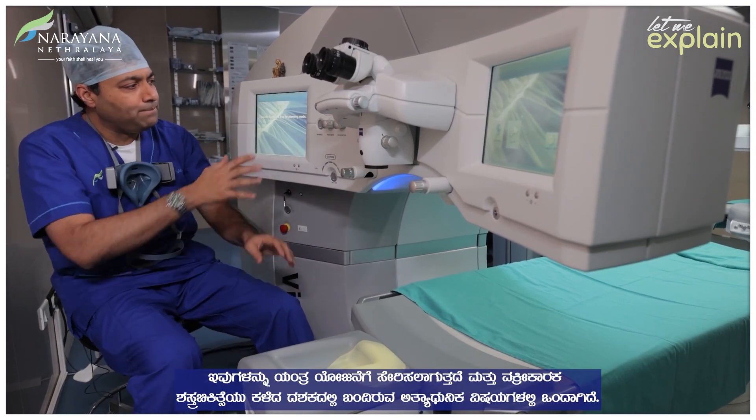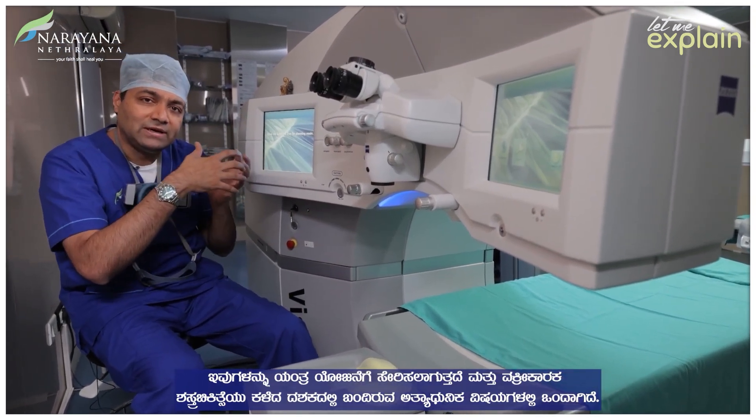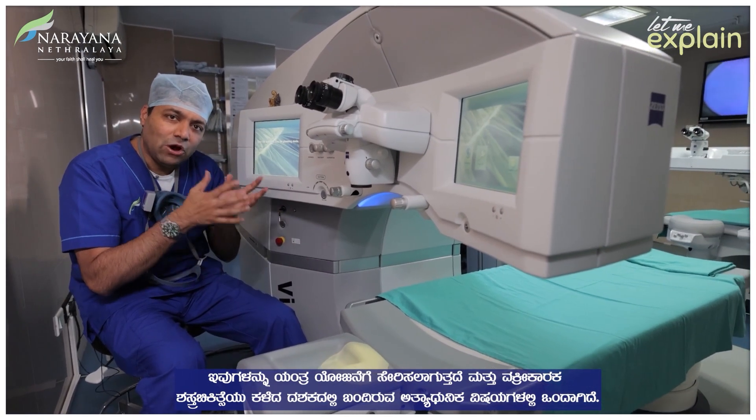There are a lot of parameters which are added into the machine's planning, and this is one of the most advanced things which has come in the last decade of refractive surgery.